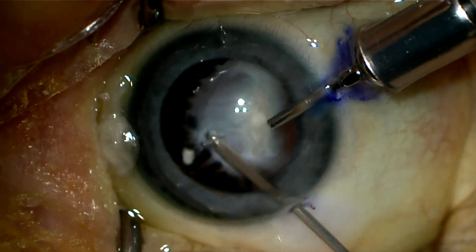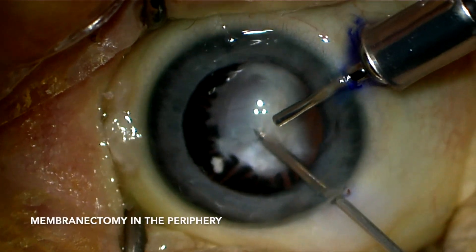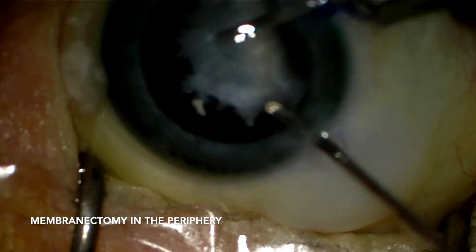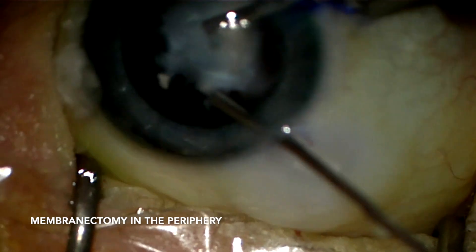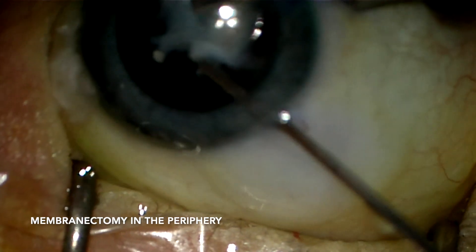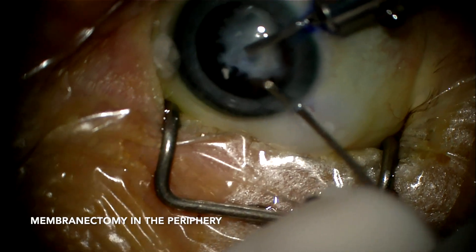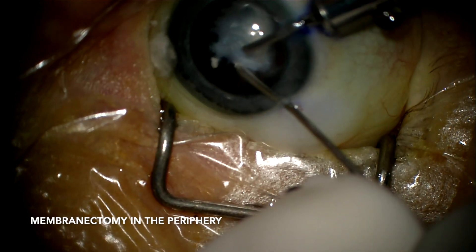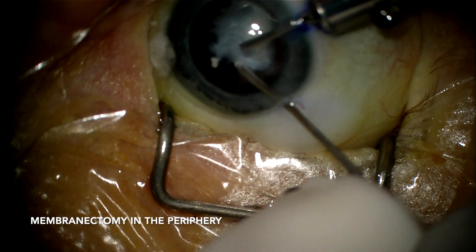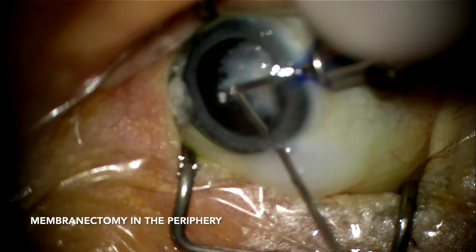Diathermy is used to coagulate them. The membrane has started to be removed from the periphery. Care is taken not to incise centrally at the beginning, as there could be more vasculature there, as well as retina.